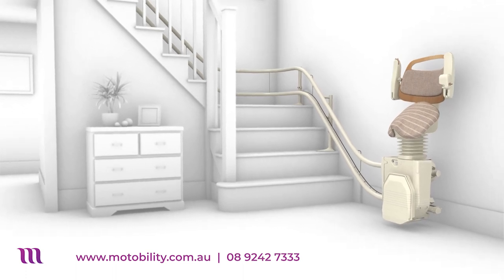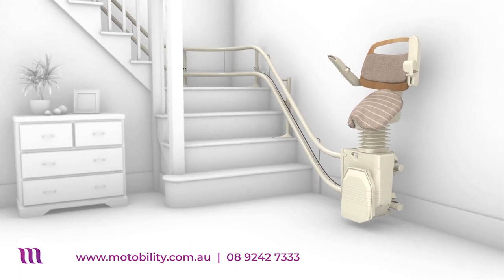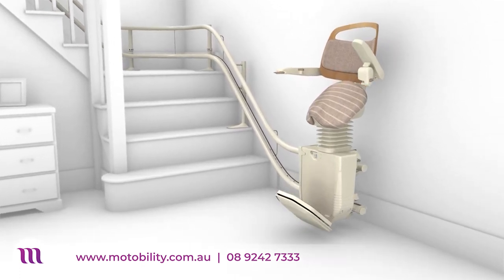The Sadler offers a new alternative to traditional and perch-style stairlifts, helping you maintain a more upright posture at the same time as taking much of your weight through the seat, minimizing the weight supported by your legs.